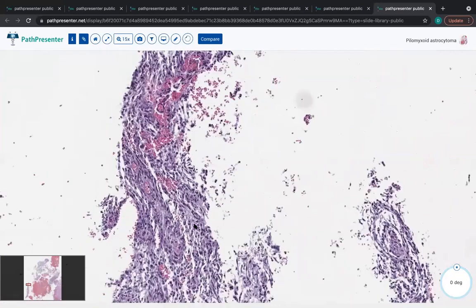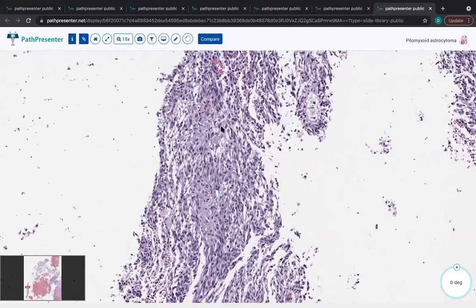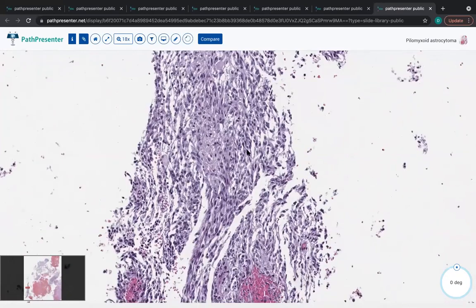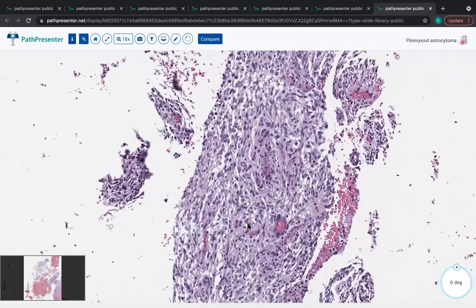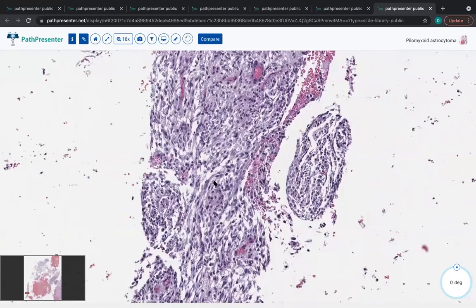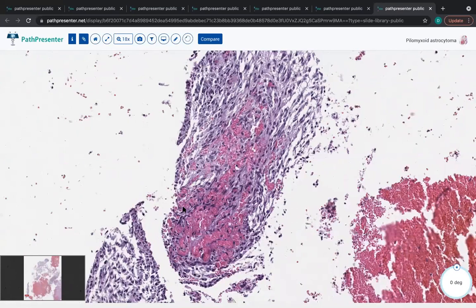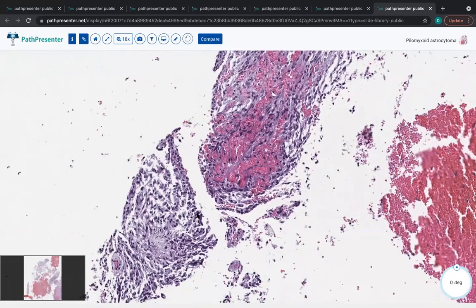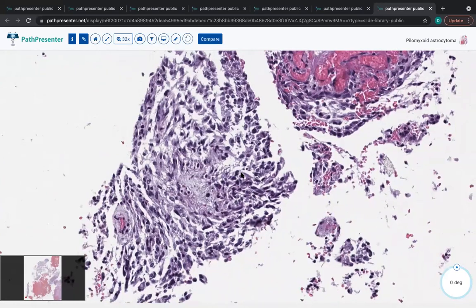If we call this a low-grade glioma with some piloid features and discover a driver event that's in our MAP kinase pathway that we expect, so be it. But it certainly doesn't have all of the classic features of pilocytic astrocytoma, namely those that I've detailed here. And like I said, it tends to be very specific for that sort of suprasellar hypothalamic anatomic location.